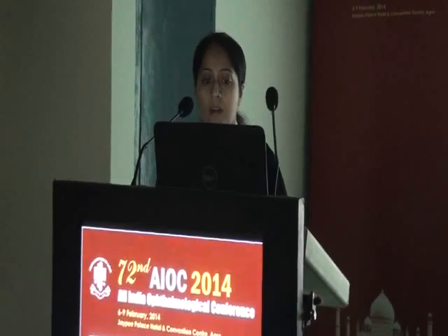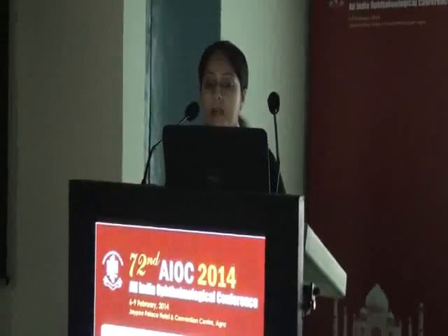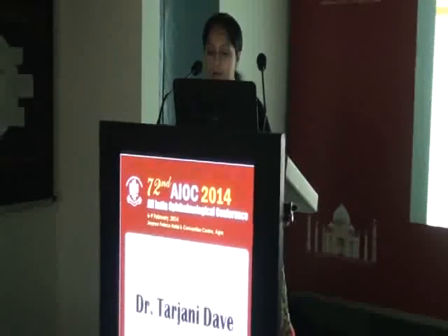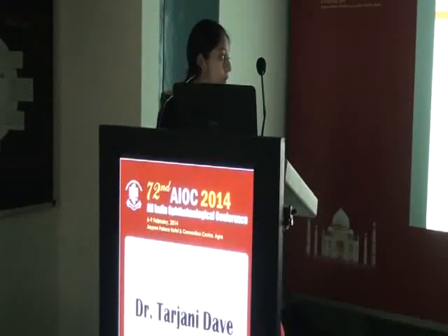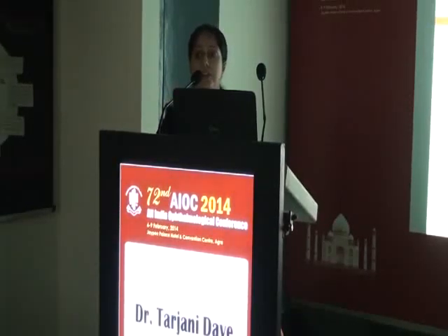In oculoplastics, you can use it for external photography or for slit lamp photography, as Dr. Fogla just mentioned. And this photograph below is one which is taken by external photography, but by attaching a macro lens to your camera.